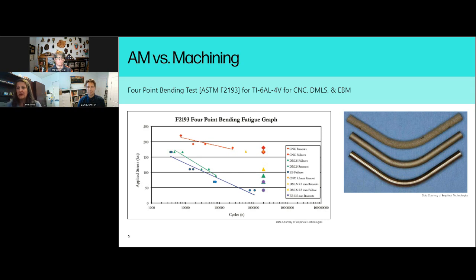The other part of it is that we don't want to have the test blocks cause failure. So especially with a lattice structure, we want to make sure that we're not testing against stainless steel for any reason, which we can do for a subtractive titanium device, for instance. But with additive, we want to make sure that we're not causing stress risers. So I hope I answered your question there, but that's definitely, again, we take a lot more pictures, we do a lot more evaluation, a lot more conversation with our clients from a partnership standpoint of, is this intentional and part of the design, or is this an outcome from the testing?